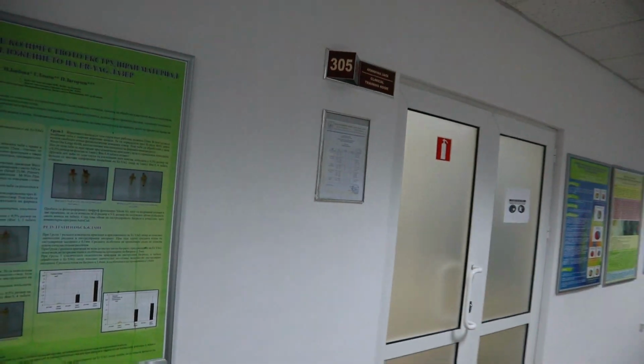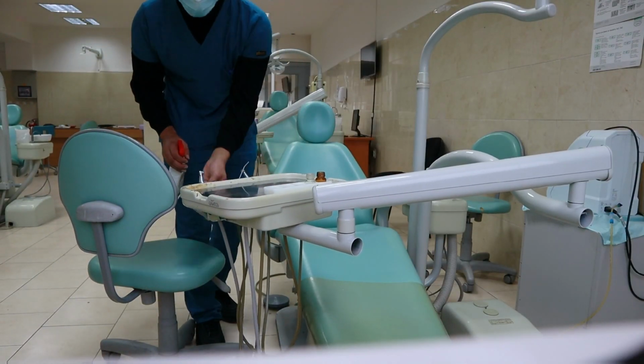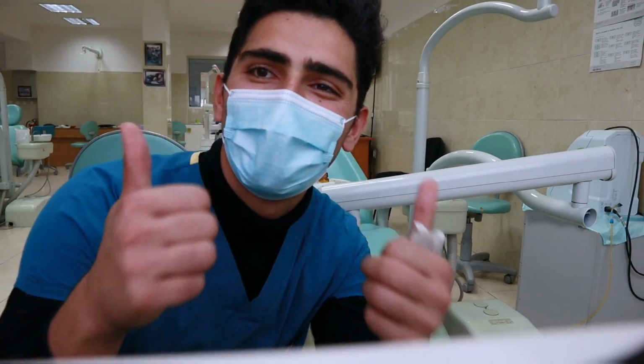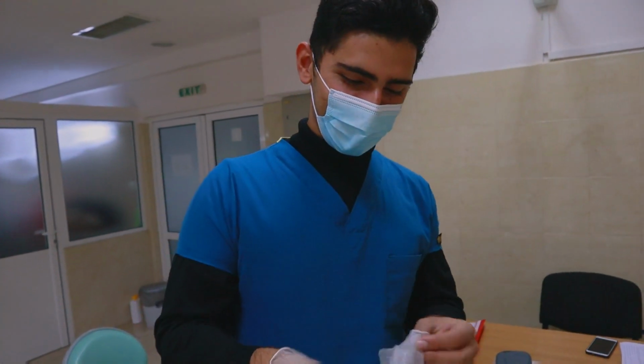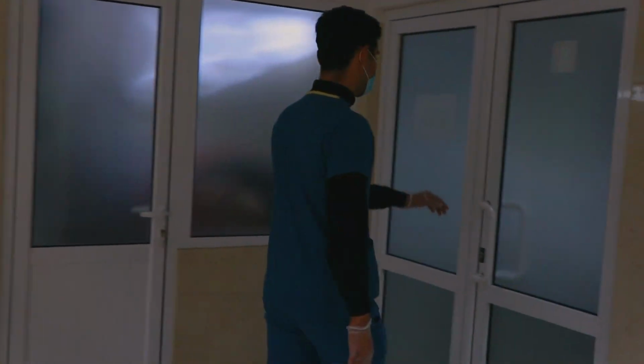The patient then sits in the waiting room, and this is the time to disinfect the patient's chair with an alcohol solution to get it ready for treatment. So yeah, we're getting ready for our patient today. You know what I'm saying, gotta put the gloves on. Once the chair is ready, I'll come outside and call you in and take you to your chair.